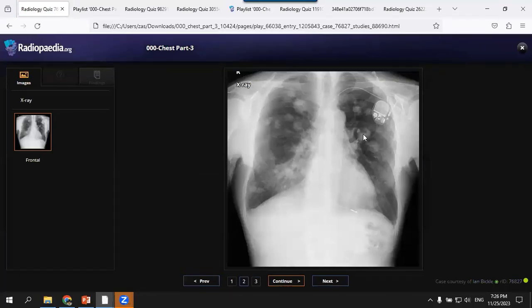If any one of these nodules shows central cavitation, then all are considered cavitating lung nodules. Cavitating lung nodules may be cavitating metastasis, maybe septic emboli, maybe granulomatosis.